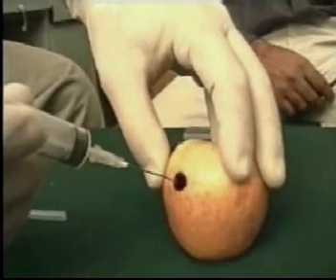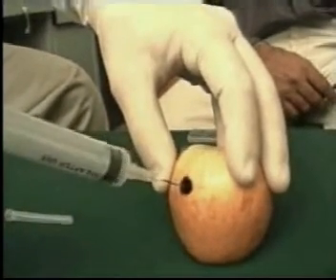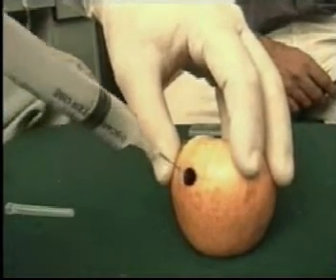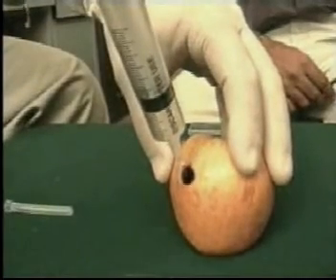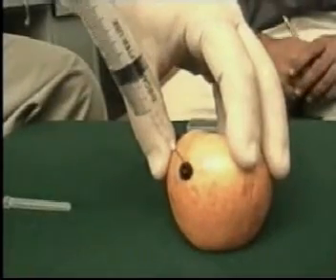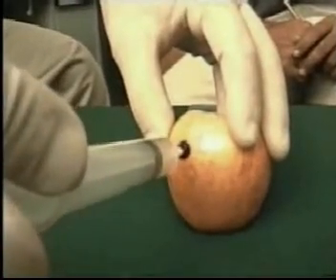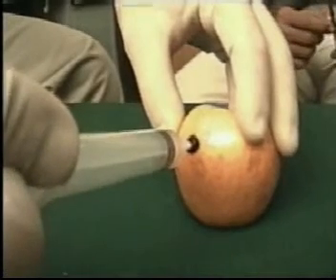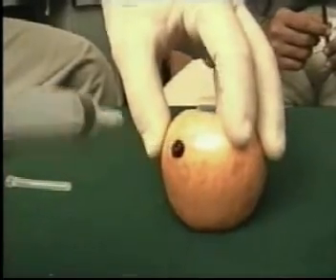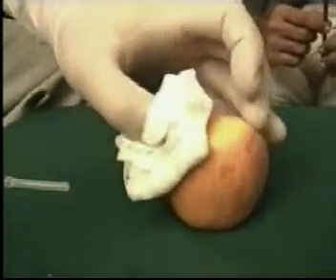With the right hand, go through the skin, entering the growth. Once inside the growth, apply negative pressure. It is a good idea to make a few passes in different directions while inside the region. Then gently release the pressure and remove the needle.